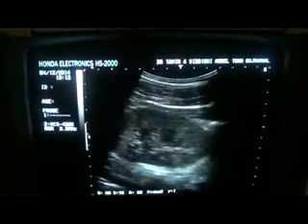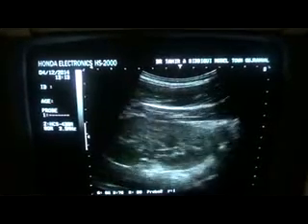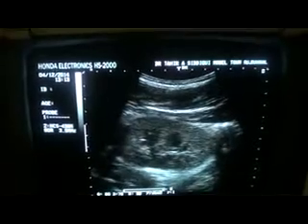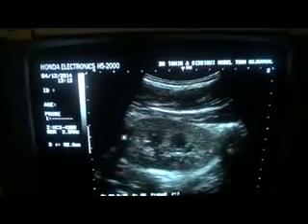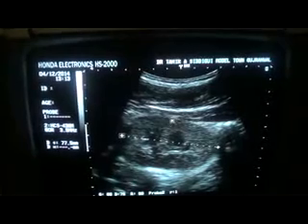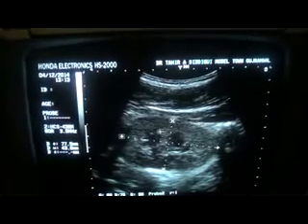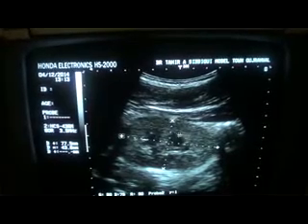Now you see that the left kidney also shows almost all the same changes that you have seen in the right kidney. See the prominence of the pyramids. First of all, the size is normal in length, 7.7, relatively small size, 4.3 in anteroposterior diameter, diffuse increased parenchymal echogenicity.